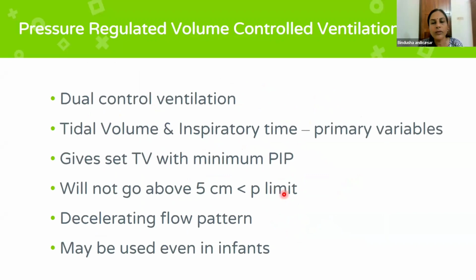Okay, we also need to know that there are some modes where there is a dual control of ventilation. So there is PRVC or pressure regulated volume control ventilation, where you can regulate the pressure and also control volume. Here, basically when you are setting the ventilator, we are setting the tidal volume and the inspiratory time.